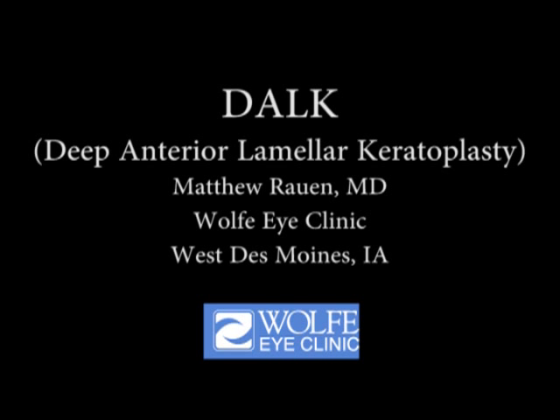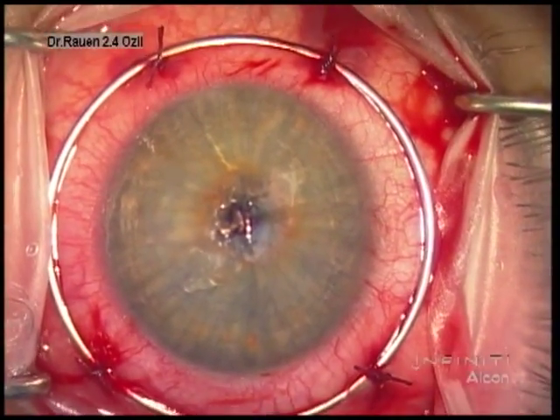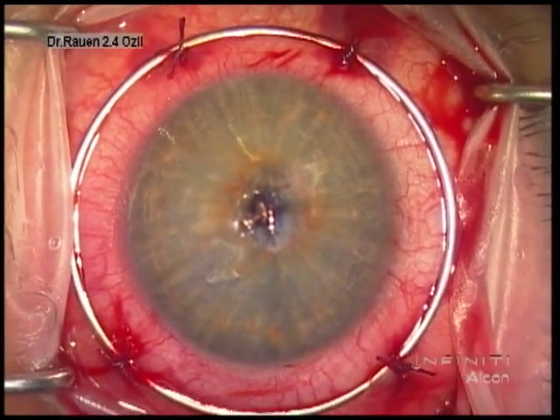Hello, this is Matt Rauen of the Wolfe Eye Clinic. We're going to share with you today an example of deep anterior lamellar keratoplasty. This is a transplantation technique that we use for some of our patients with keratoconus, some with deep stromal scars, and others with deeper stromal dystrophies. Most cornea surgeons who utilize this technique will probably tell you it's one of the most rewarding surgeries we do because of the great service it's providing to the patient.